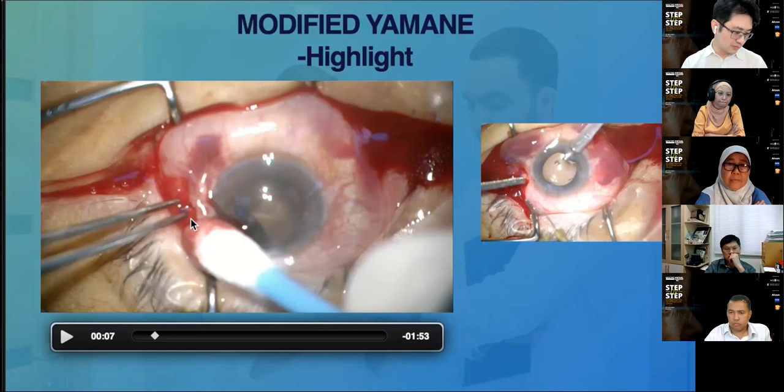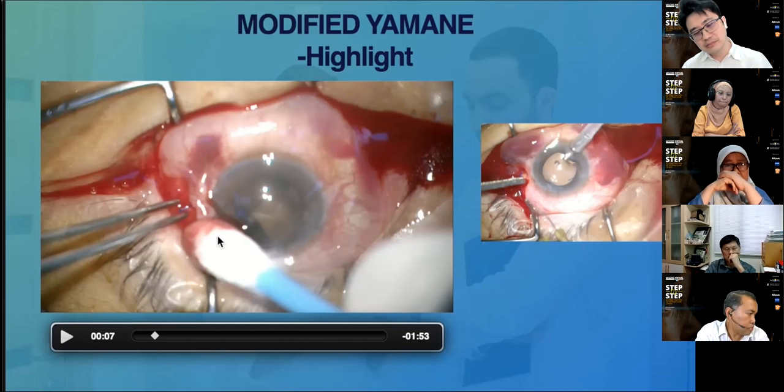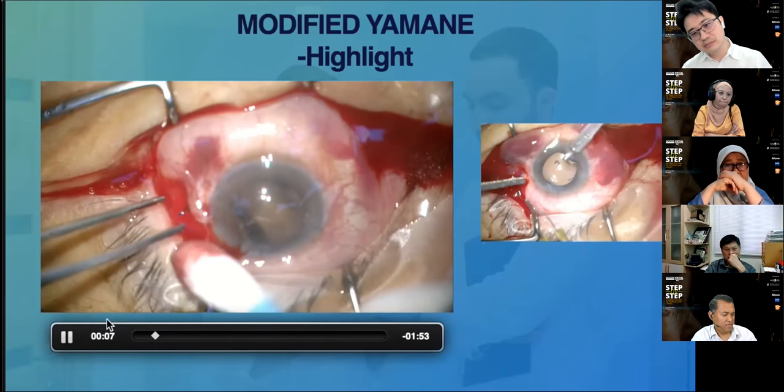But then the anchored haptic is tucked in nicely in the scleral bed. So what we need to do is partially dissect the conjunctiva, partially dissect the sclera to gain access of the dangling haptic. So we slowly bring up the intraocular lens back into the anterior chamber.